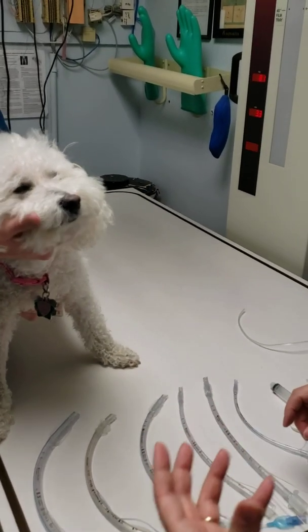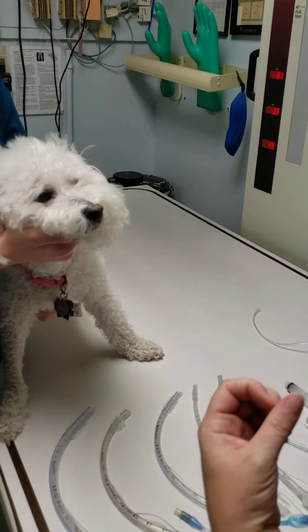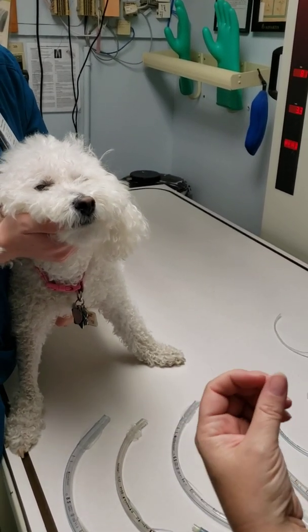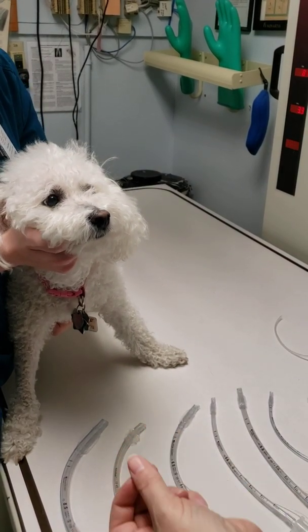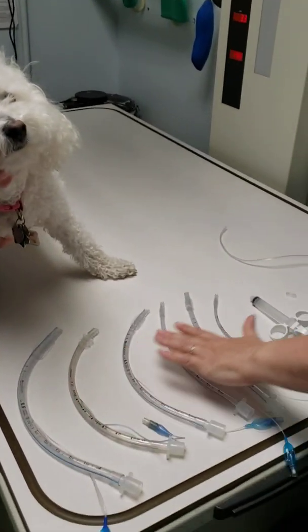To select the proper size endotracheal tube for your pet, you really have to look inside the mouth. Everything up until this point is your best guess. Your PowerPoint will let you know more information, but what I did here was select multiple sizes of tubes.